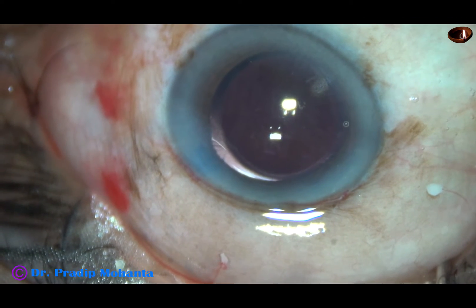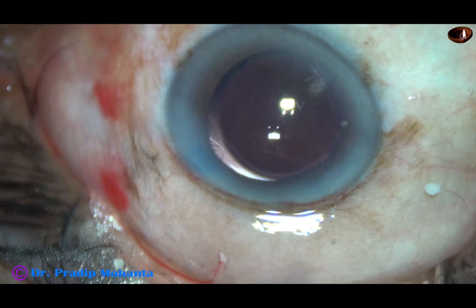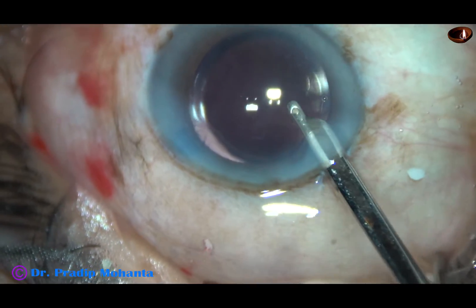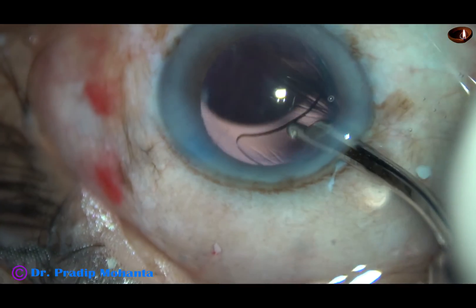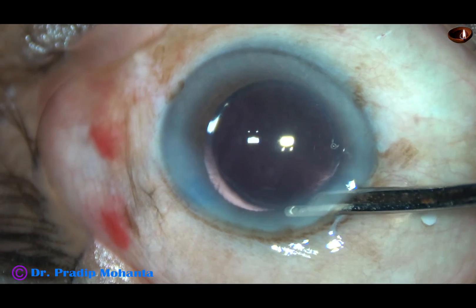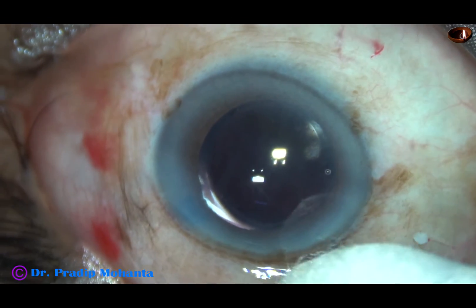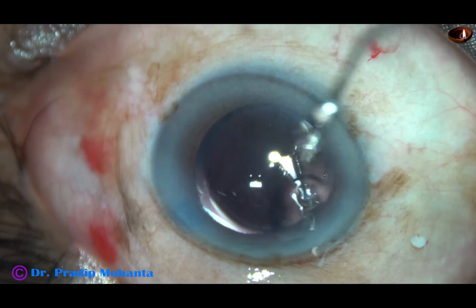Now I am going to do a final lavage of the anterior chamber, because some visco sticks to the corneal endothelium — unless we direct a gentle stream of fluid towards the cornea, this visco doesn't come out. I go behind the IOL once and irrigate the bag. Then I form the anterior chamber very nicely with the Simcoe and come out. Check the integrity of the wounds and apply a few drops of moxifloxacin over the ocular surface, then conclude the case.